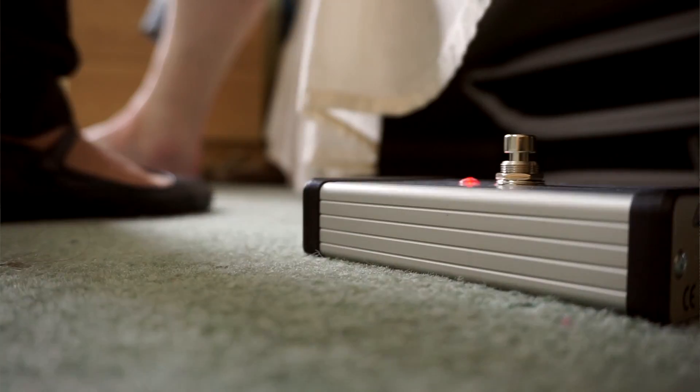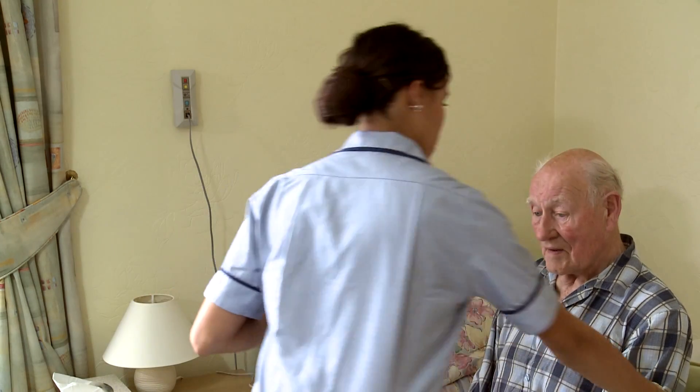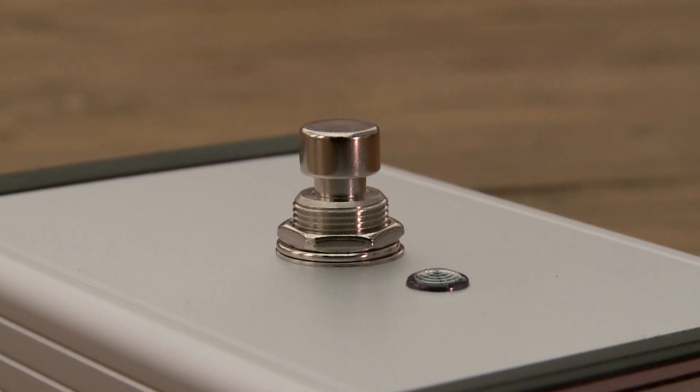It's got an amazing little foot switch that takes 20 stone of pressure, and what that stops is any cross-contamination. With the pressure mat, staff going in, repositioning it, pulling it out from under the bed — you don't have that with the LiveLink movement sensor.